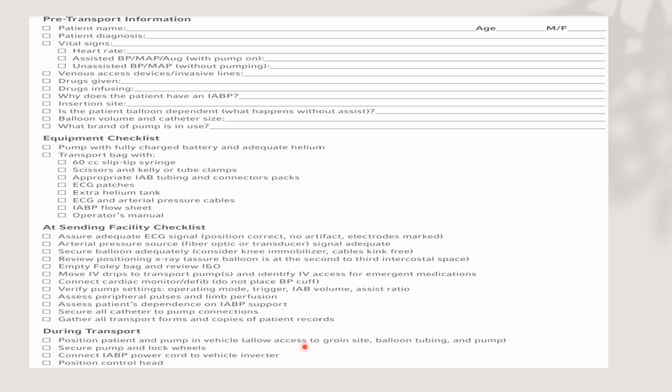If we have a problem regarding a gas alarm, we should check it and clamp the balloon immediately to avoid gas leak inside the patient. And we should have good experience dealing with vasoactive drugs and volume while we are managing the patient during the transportation.